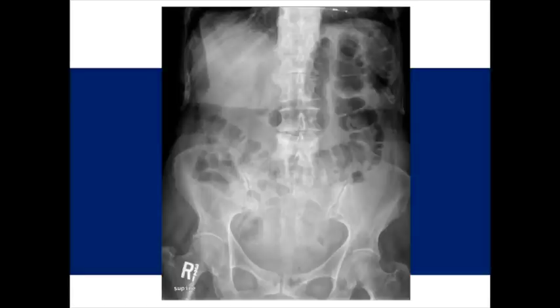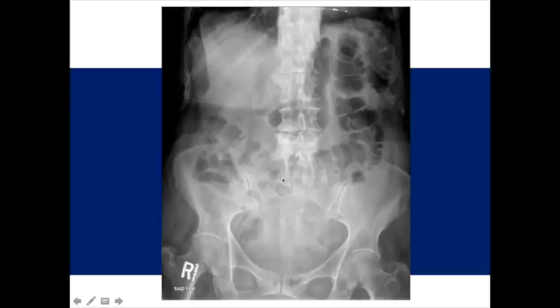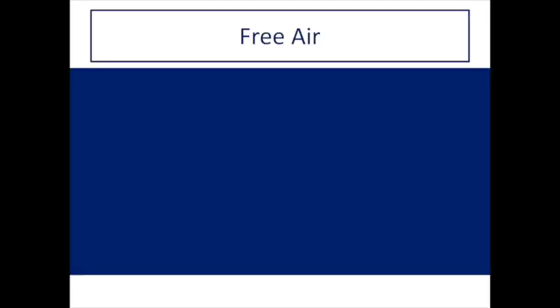Back to our case: if you were looking under the diaphragm, don't feel bad — it's a common mistake for beginners. The patient is supine on this film, which means that if there were free air, the air would come to the anterior belly and not under the diaphragm. Supine radiographs are not very sensitive for free air, and it's difficult to detect on supine films alone unless you have a very high volume of free air.